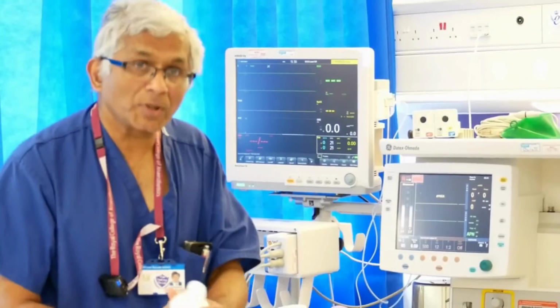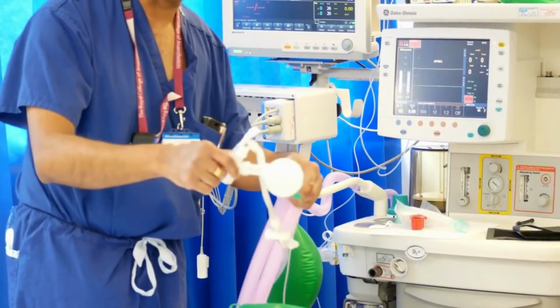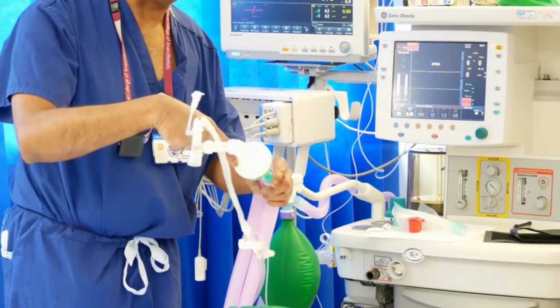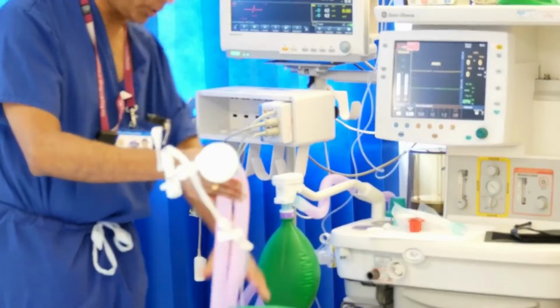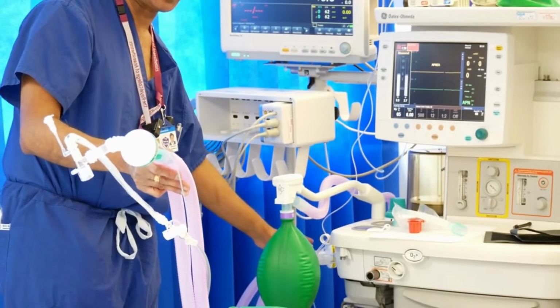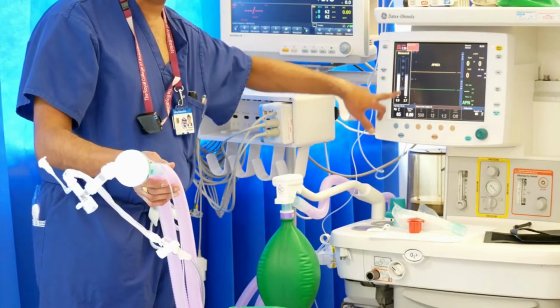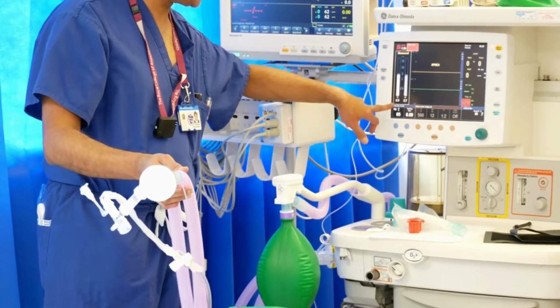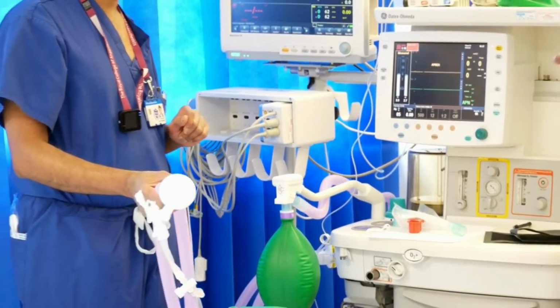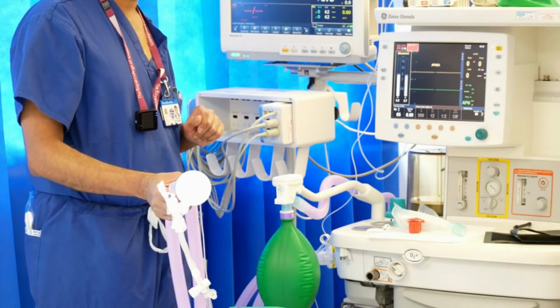Check from the patient whether there's any disconnection of the tubing, whether there's any fluid collection in the filter, and then go along the tubing checking for any disconnection, and whether we are delivering the oxygen to the patient. The oxygen is coming through a pipe system here, so there's unlikely to be any problem related to an oxygen cylinder going off. We are running the ventilators on a pipe system.